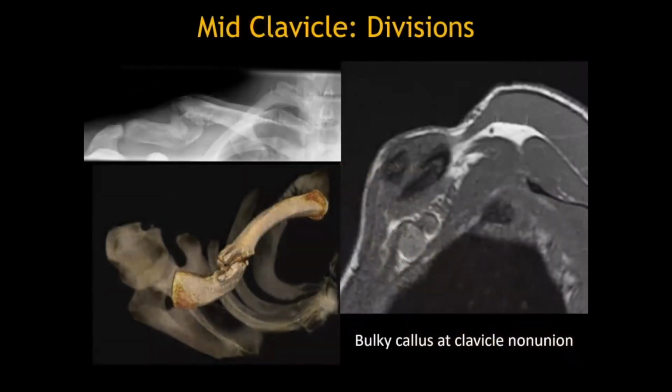As we move more peripherally into the second anatomic space, which is the costoclavicular space, this is where we may encounter hypertrophic non-unions or malunions of clavicle fractures, resulting in impingement of the brachial plexus in that costoclavicular space. You can see deep to the clavicle, there is a muscle here referred to as the subclavius muscle, and just beneath that muscle are the brachial plexus nerve elements.